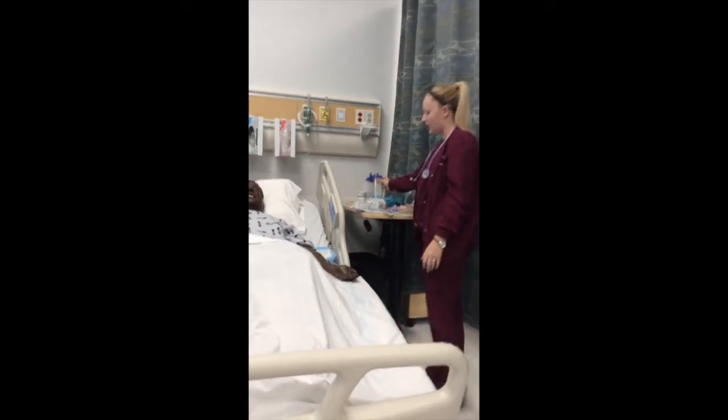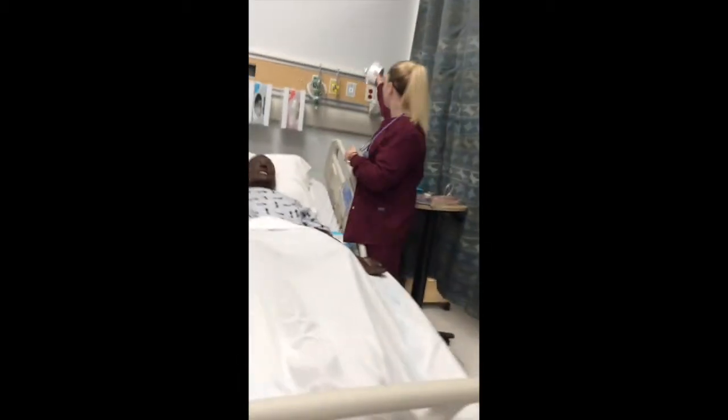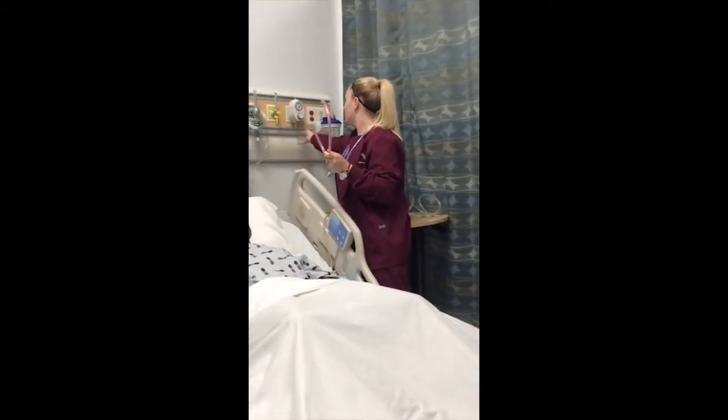First thing I'm going to do is I'm going to go ahead and hook up my suction equipment. I'm going to go ahead and check this, make sure it's suctioning, turn it on, make sure it's suctioning.